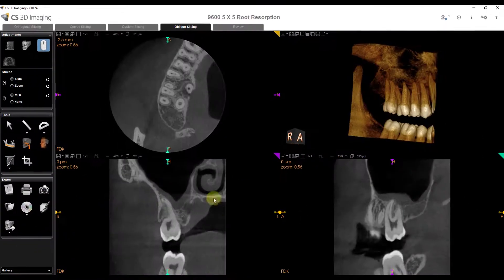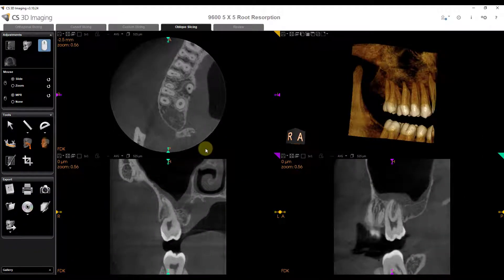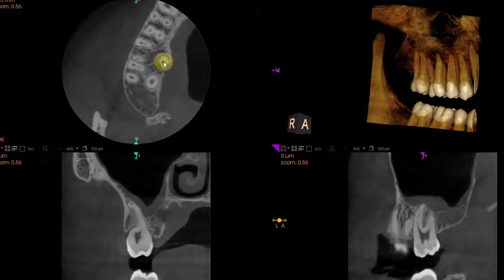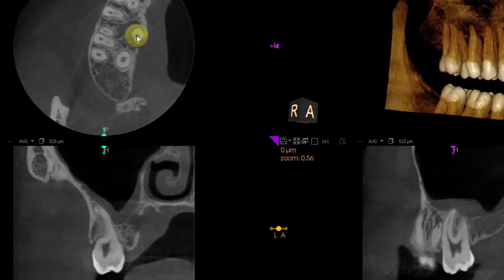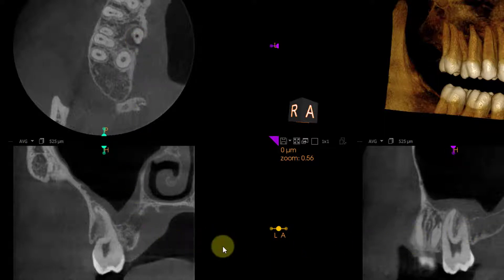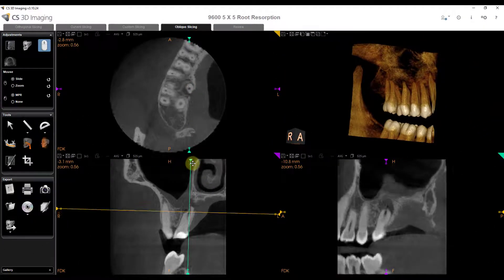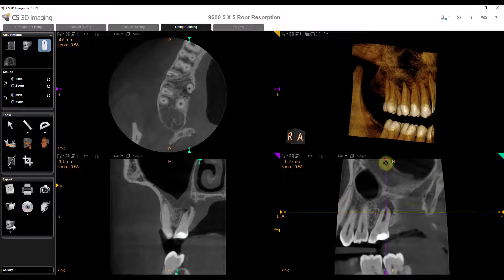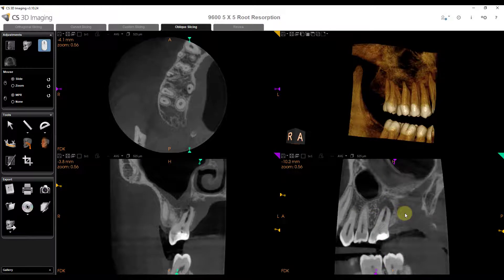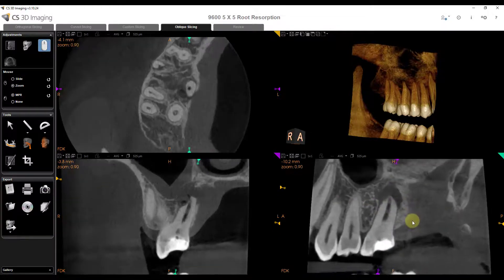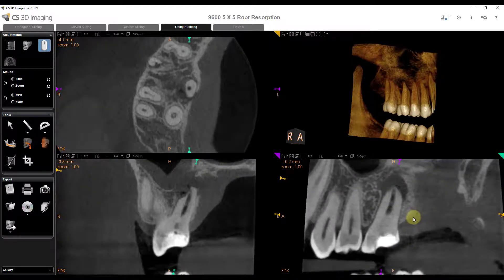Another example of that — and another feature if you're not familiar — is I can point my mouse to anything, use the mouse wheel like a button and push down on it, and you'll see the other views will all be centered on wherever I press. Now I can change the angle of my slices to the long axis, and then use Ctrl A to zoom in, Ctrl A, and I can slice back and forth.